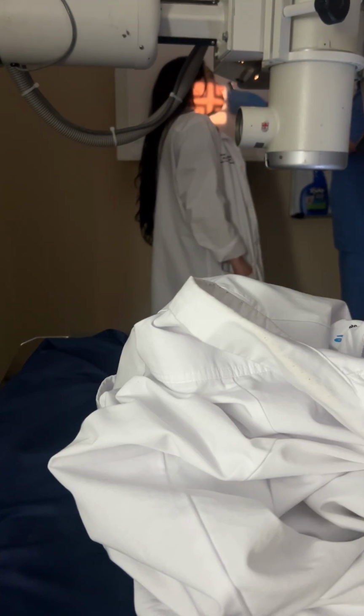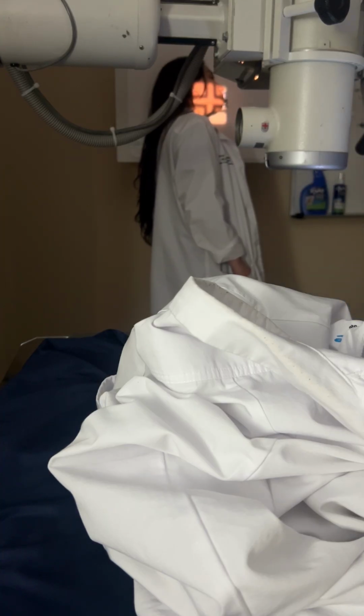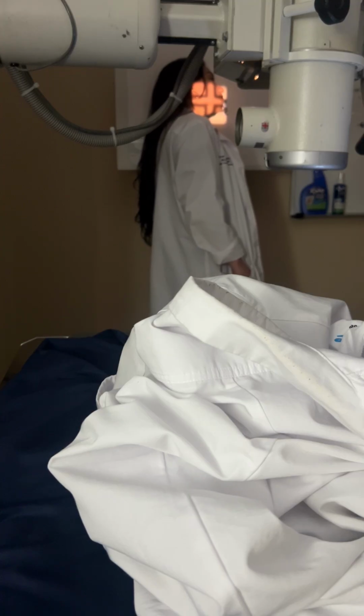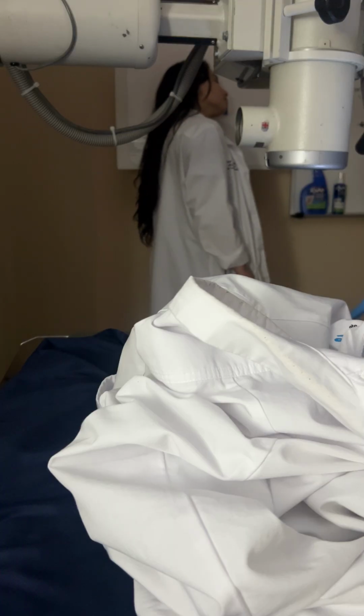This will be for the general survey, and this is an axiolateral oblique, or an axiolateral, basically, okay? Questions? 2 options. Angle the CR 25, angle the patient 25. And it's caudad? Or no, this would be cephalic, yes.